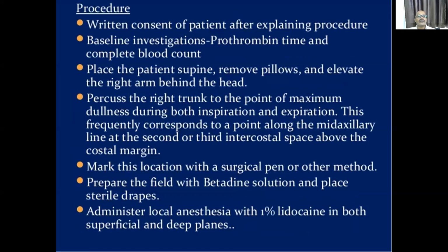So what is the method? Procedure. The patient lies in a supine position. The written consent is taken after explaining the procedure, and all the baseline investigations: the coagulation profile, the prothrombin time, the hemogram, that is the complete blood counts. The patient lies in a supine position.